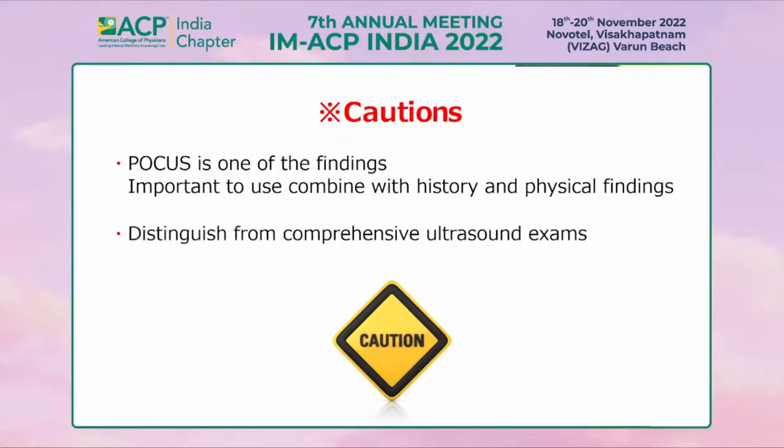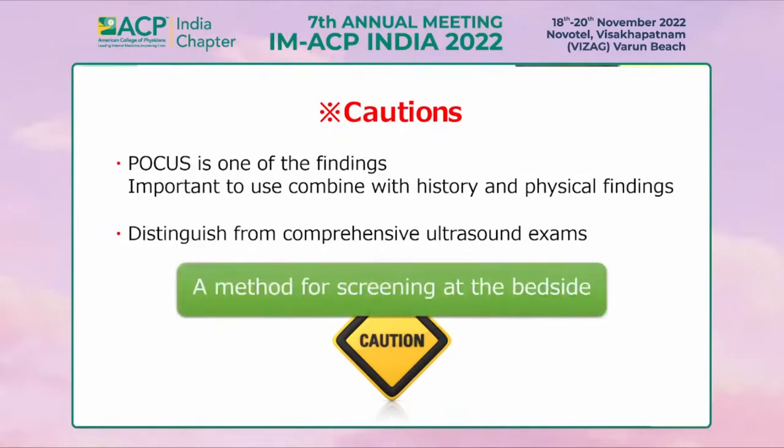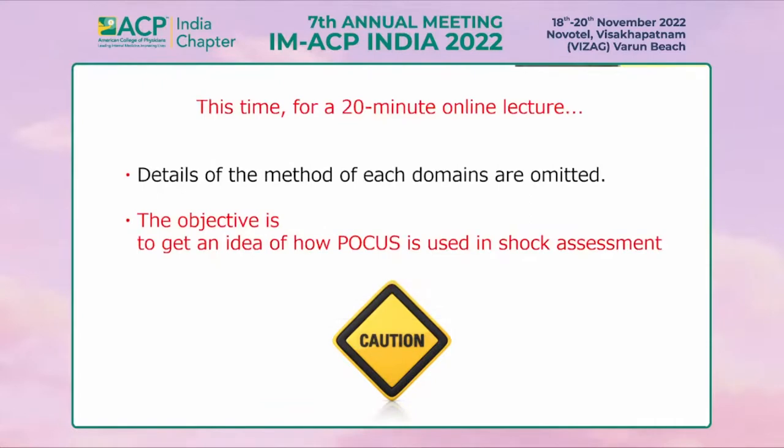POCUS is distinguished from comprehensive ultrasonography. It's a method for screening at the bedside. Today, we have only 20 minutes, so I'm going to omit the details of the method of each domain, for example, FOCUS, lung, DVT ultrasound, and abdominal ultrasound. The objective of this lecture is to get an idea of how POCUS is used in shock assessment.